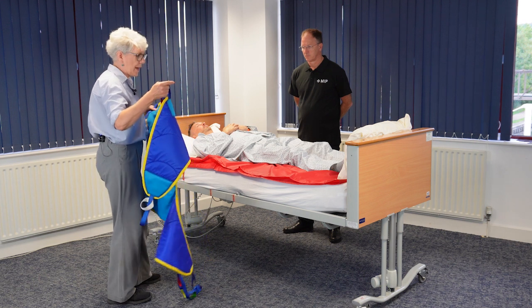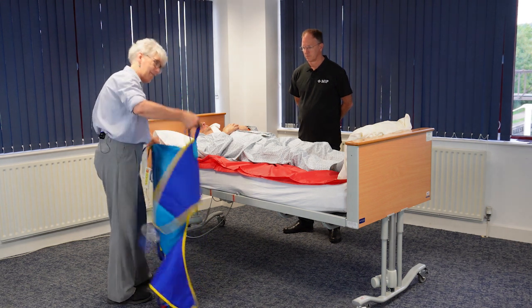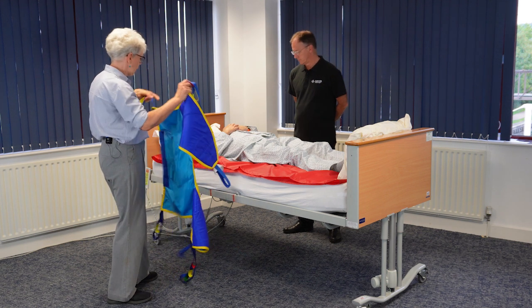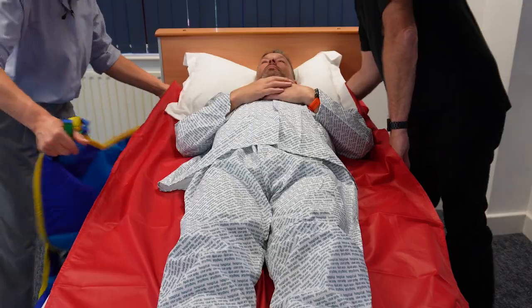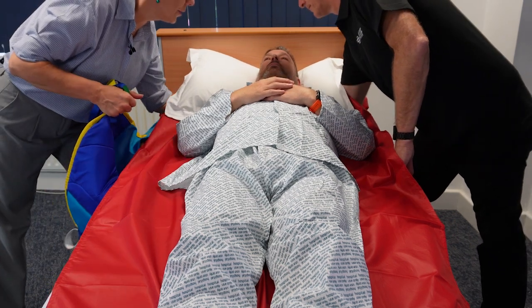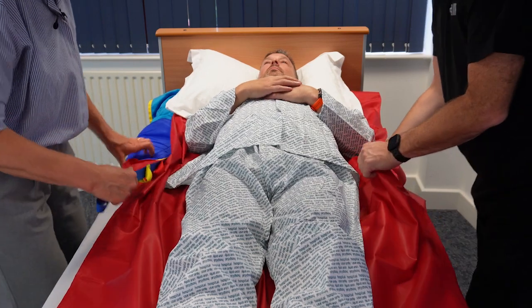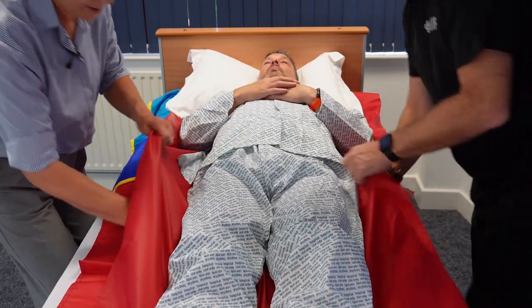Making sure that the label of the sling is facing downwards so it's the right way for the patient. I'm going to use the loops to thread through. I'm going to thread one loop through the middle and pass that across to Chris, and he's going to pull through gently.